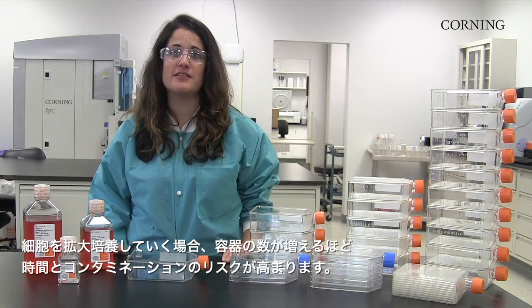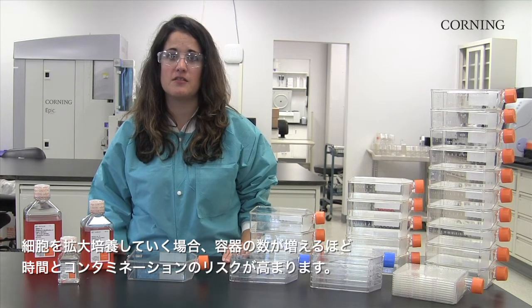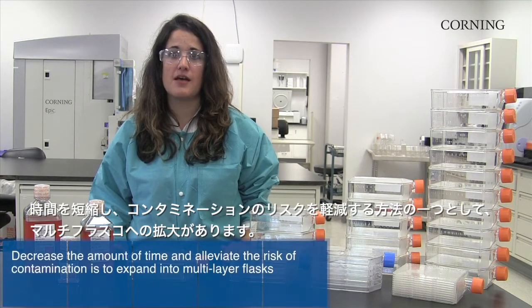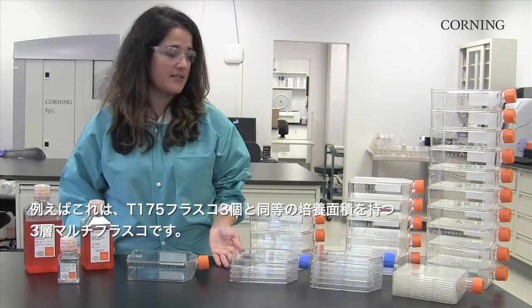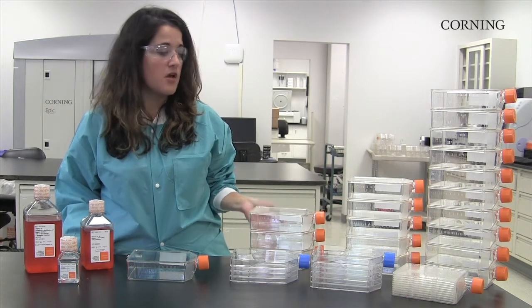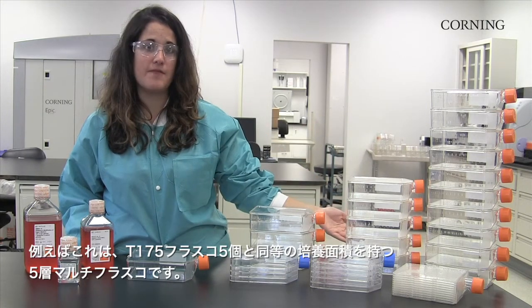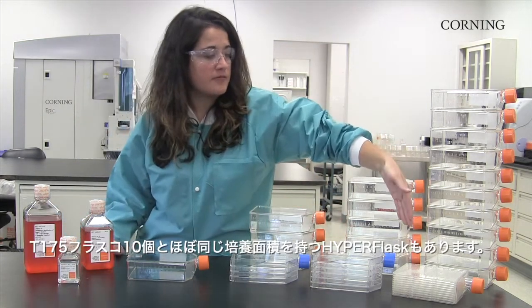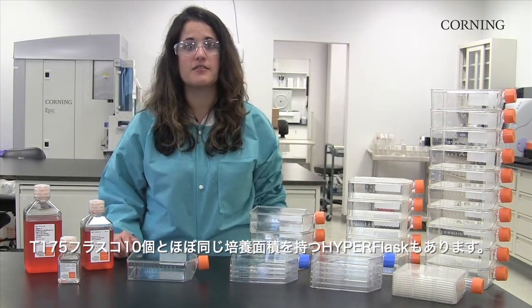When expanding cells into multiple vessels, the amount of time and the risk of contamination increases. One way to decrease the amount of time and alleviate the risk of contamination is to expand into multi-layer flasks. For example, here I have a 3-layer flask, which is a similar growth area to 3 T175 flasks. We have a 5-layer flask, which is the same growth area as 5 T175 flasks, as well as a HYPERFlask, which has a similar growth area to 10 T175 flasks.